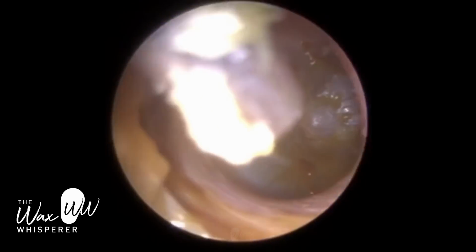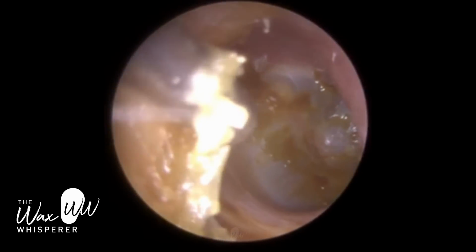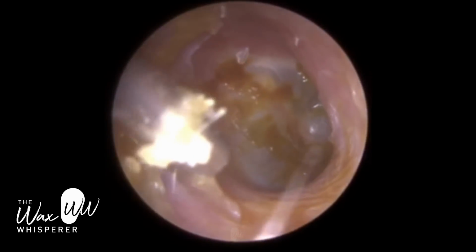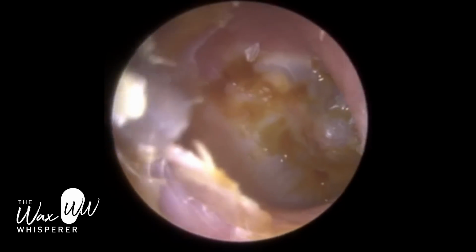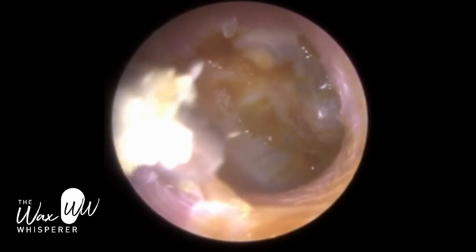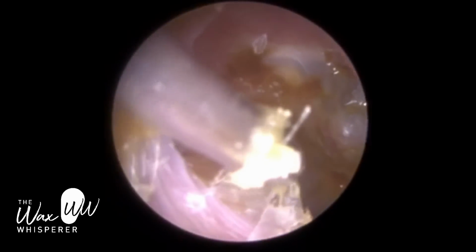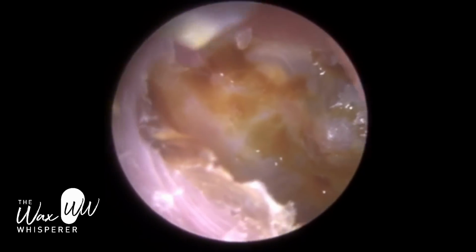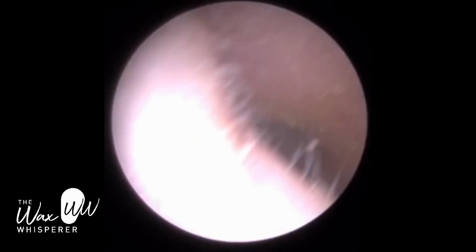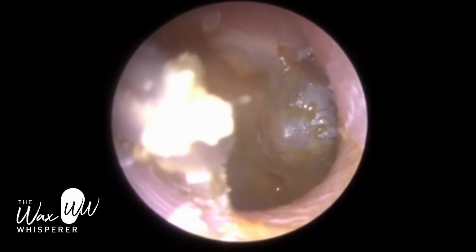I can appreciate that in terms of viewing, it's still a bit messy, it's a bit stained, but we're not going to remove every little speck of wax, guys. Some of this is staining. So if you imagine, you've had your Christmas lunch, you had all that gravy on the plate, you can finish the plate, all the roast potato, your sprouts, your turkey, your pigs in blankets, all your veg, but you're still going to have gravy unless you lick the plate clean, which, well, I sometimes do, I'm guilty as charged. That plate is still going to be stained with gravy, and the only way you can remove that is by licking it. Now I'm not going to go inside this patient's ear and lick their eardrum, and you can't obviously suction it all off because it's just stained.